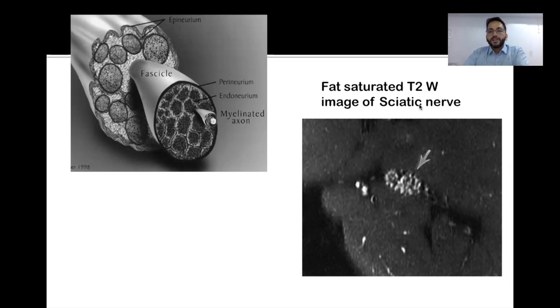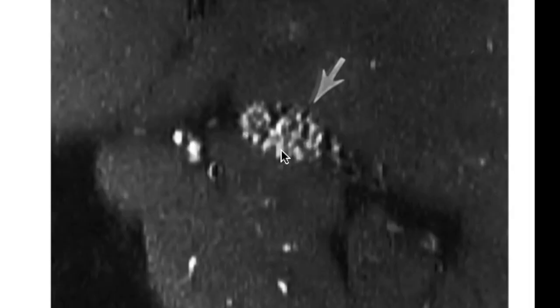This is a fat-saturated T2-weighted image of sciatic nerve which clearly shows this anatomy. These small hyperintense areas are the nerve fascicles which are in turn separated by these black dots which is the suppressed fat, intervening fat between the fascicles. This is a fat-saturated sequence so the fat is going to appear black here.